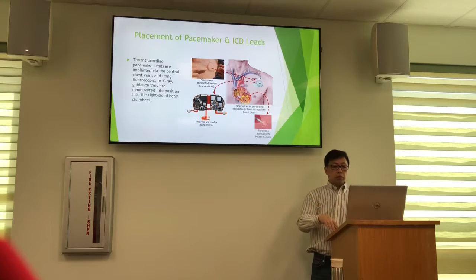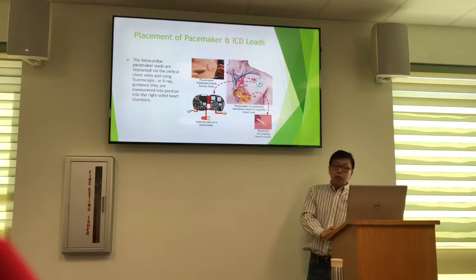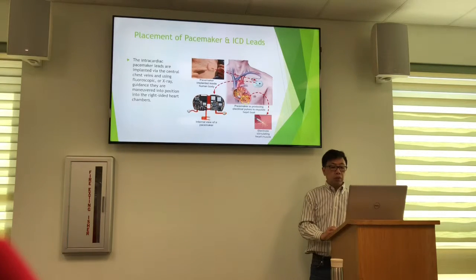It will be inserted to the atrial and ventricular positions. Testing of sensitivity will be done at this stage. Make sure it has the correct sensitivity and the correct voltage to the heart that it will pace. Once the lead passes the threshold and all the tests, the device will be connected and programmed by the vendors.